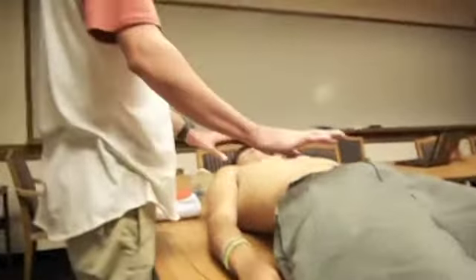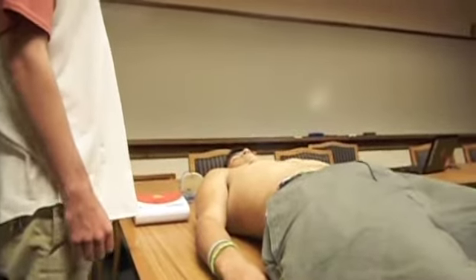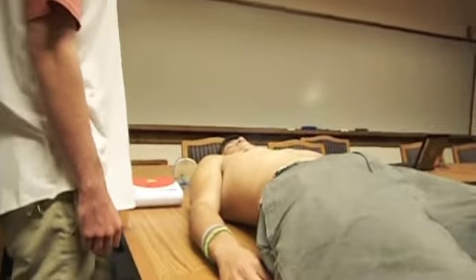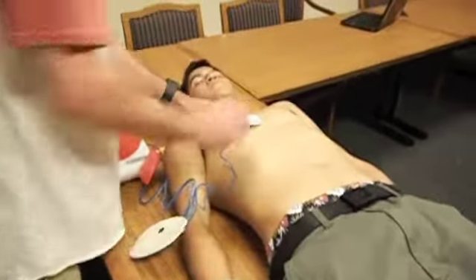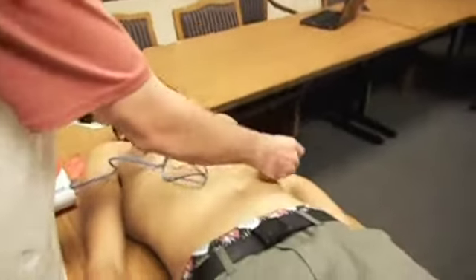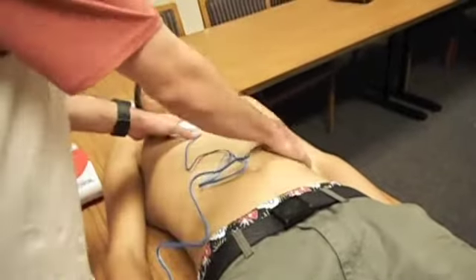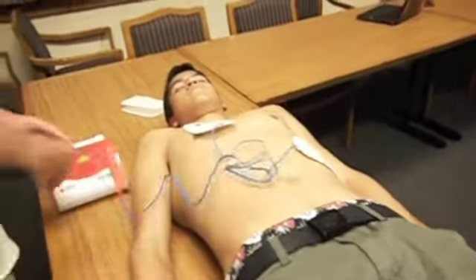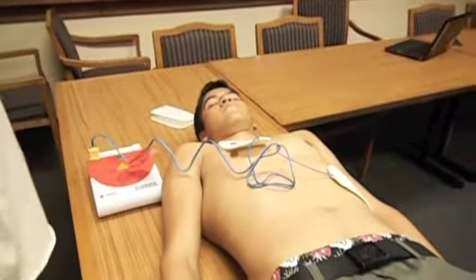From person's chest. Attach pads firmly to person's chest as shown. Plug-in connector. Analyzing rhythm.